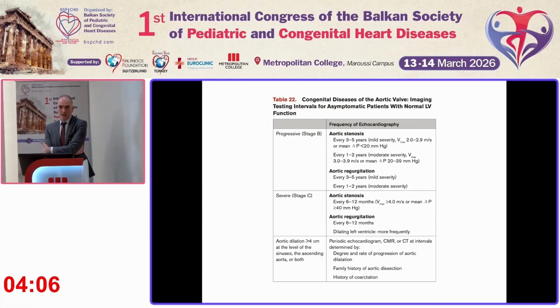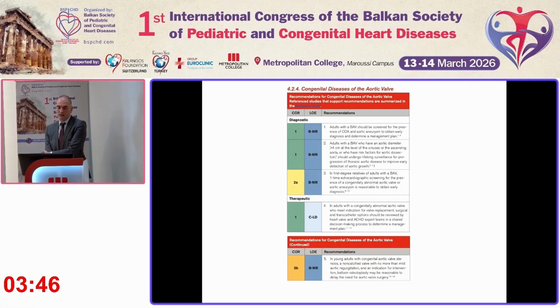Things are different when there is a concomitant aortopathy. There, we should think of cross-sectional imaging. It's obvious. We have three-dimensional imaging of the whole thorax. So there are advantages with cross-sectional imaging. If the question is on longitudinal follow-up, this should be an MRI because of the lack of radiation, because of its safe nature, because we are not always in need of contrast unless we think of a complication or there are new findings that are not clear. So without the use of radiation or a contrast agent, we could follow up a patient, monitor him for years.